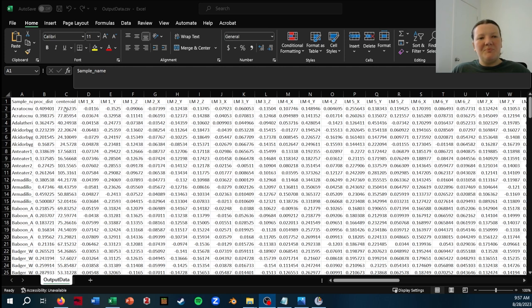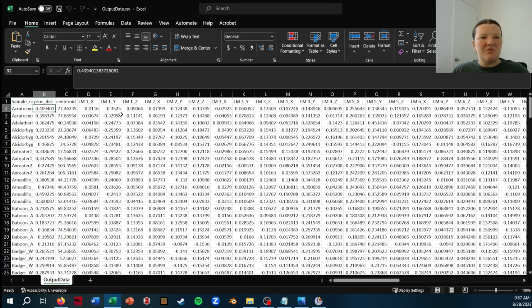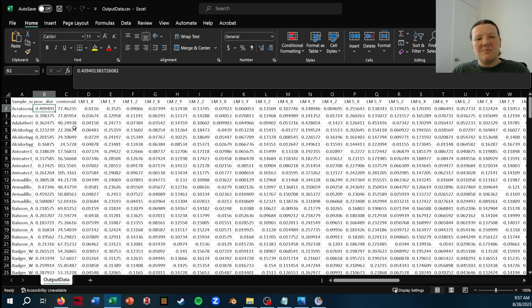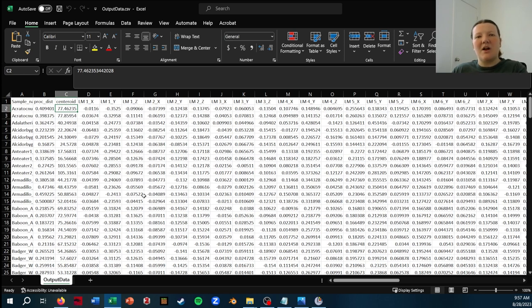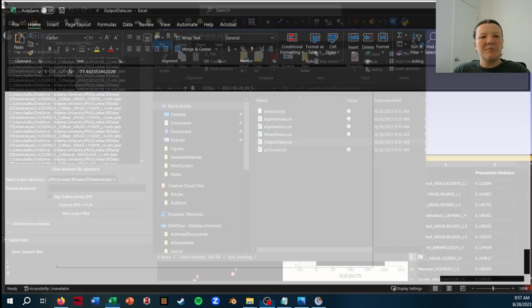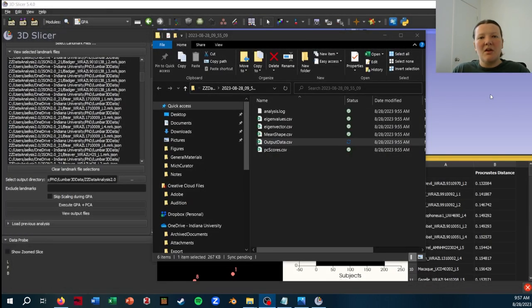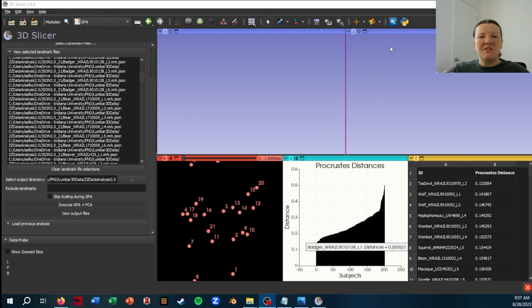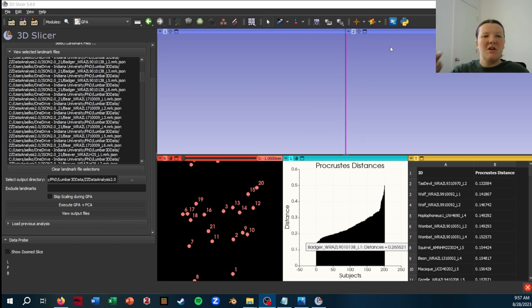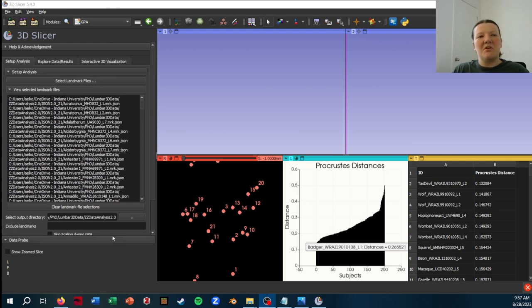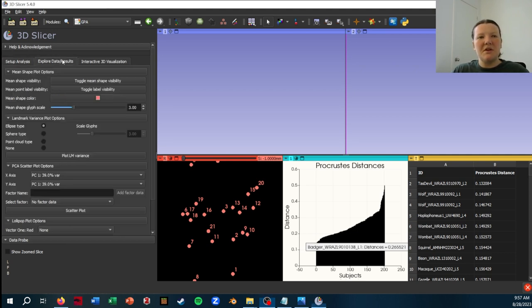You also get the Procrustes distance from the mean for each of your specimens. And then you also get a centroid size, which is really nice if you kind of want to backtrack the landmark coordinates. So if you're just interested in getting your landmarks out of Slicer in a nice format, that is the way to do it. But there are some other good tools in SlicerMorph that you can use.